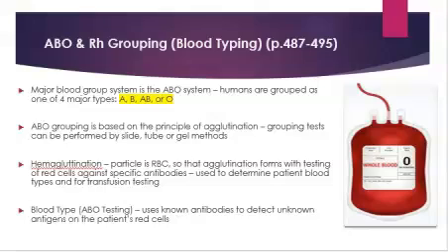We're going to use the concept of hemagglutination for our blood type testing. This is where we're going to use our red blood cells against antibodies to look for agglutination. And this helps determine the patient's blood type, and it's used for transfusion testing. Or in other words, help match a patient when they need a unit of blood. In blood type testing or ABO testing, we're going to use known antibodies, that's going to be our reagent, to detect unknown antigens on the patient's red blood cells.